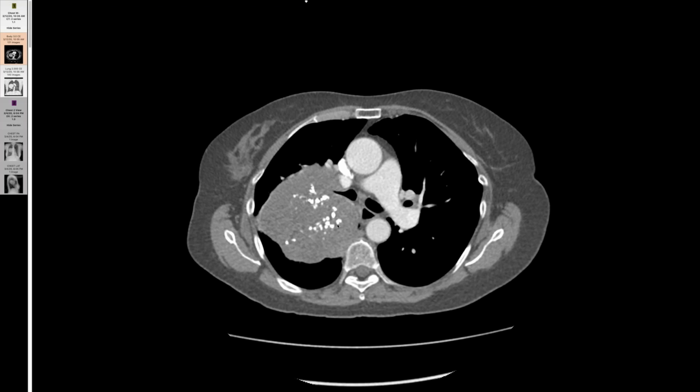Yeah, I think that case would be strong if you had mesenchymal elements within the airway elements plus the epithelial elements and the mesenchymal elements. That would make it reasonable to call that a hamartoma, but I'm not able to address your question with any more sophistication. Okay, so the world's largest hamartoma, I'm going to let it go at that.